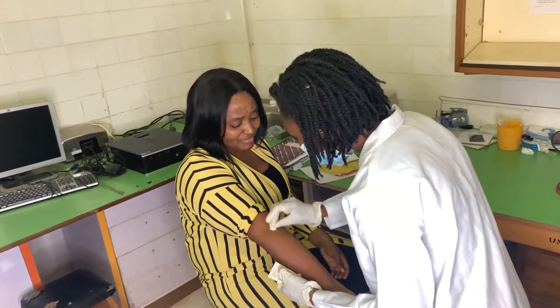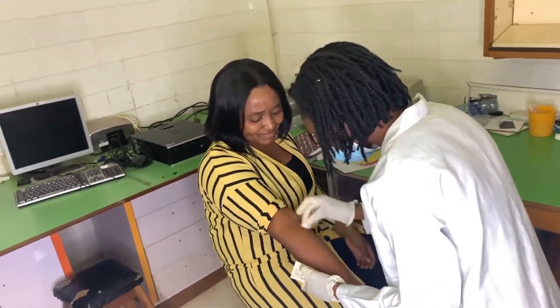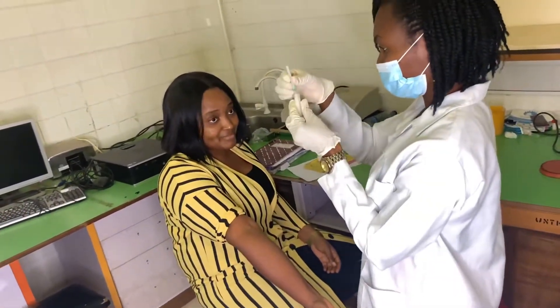The first step, which is always the sample collection step — as you can see, she's trying to disinfect that place by swabbing the area of collection with alcohol.